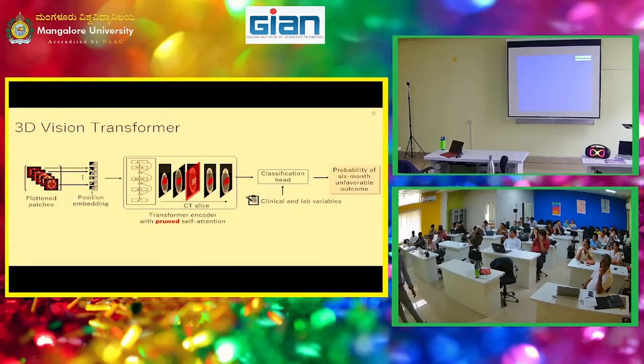So you have the image itself, and then the position of the tokens within the image. No, not each image, each patch. It's tokenized. It's all tokenized, okay? And so then you get the position, because you're feeding it all into the model, right? So it needs a position. It needs to understand the position, because you have a 3D transformer, right? You have multiple slices. So all that positioning is this embedding.